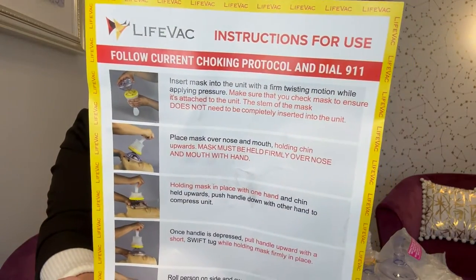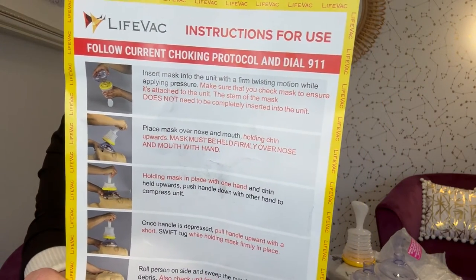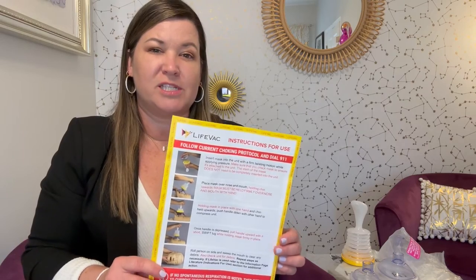At the very top it says: follow current choking protocol and dial 911. This isn't saying be a hero or don't call actual first responders. But sometimes if you've had to call 911 lately, they're strapped — we don't always get the quickest response. And as we both know, choking can end a life in a matter of seconds, not just minutes. So I wanted to present this as an option for you to consider for your family.